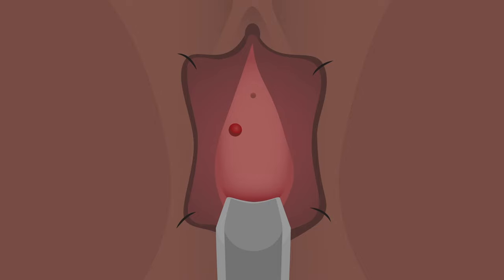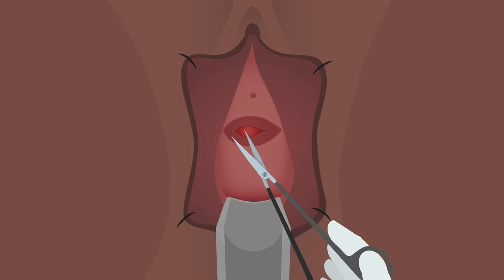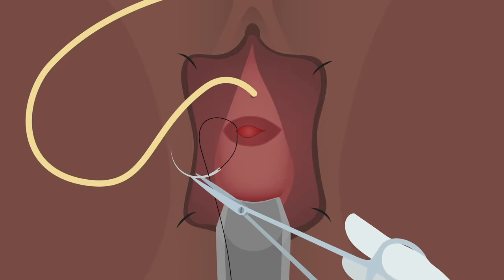Sharply circumscribe the fistula with an 11 blade, scoring the vaginal epithelium and create lateral flaps on each side. Make sure to look for the ureters before excising the fistula using the scalpel or scissors.